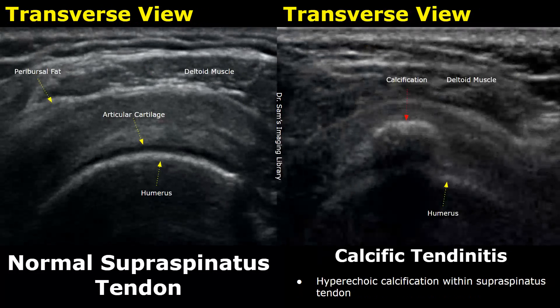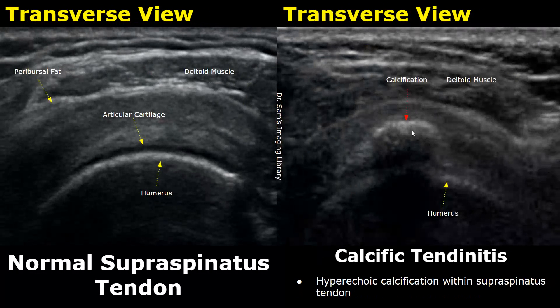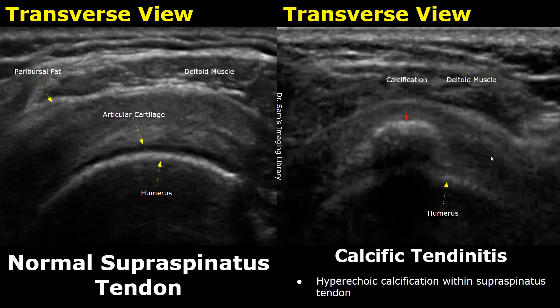Calcific tendonitis can occur in the supraspinatus tendon. In this case, we will find a hyperechoic calcification with posterior shadowing within the supraspinatus tendon.